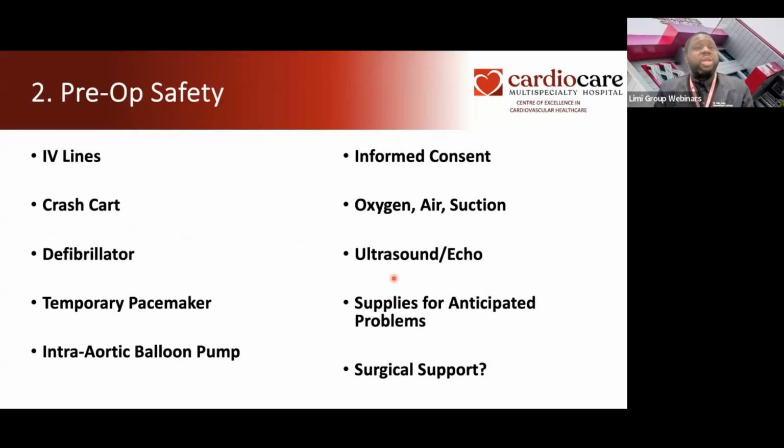Or sometimes patients will need a temporary pacemaker while you are doing the procedure. So if the person goes into a heart block, the temporary pacemaker will take you through, you finish the procedure, open up the blood vessels, patient is fine. I've had to use this on several occasions. Now, we know temporary pacemaker is quite expensive, but it is life-saving, and you should not really be doing a coronary angio without having some of these things on hand or nearby within your reach.